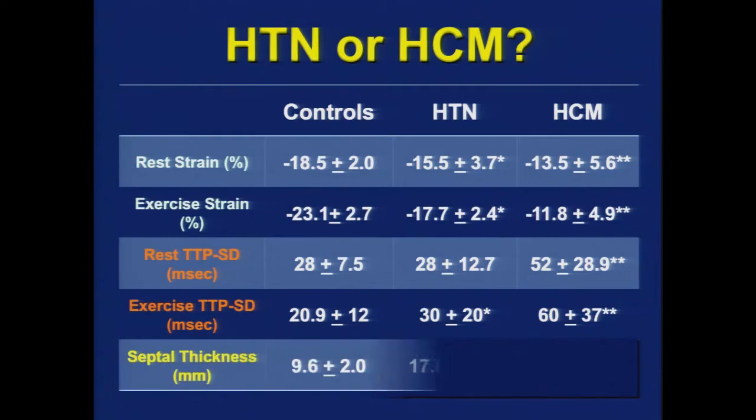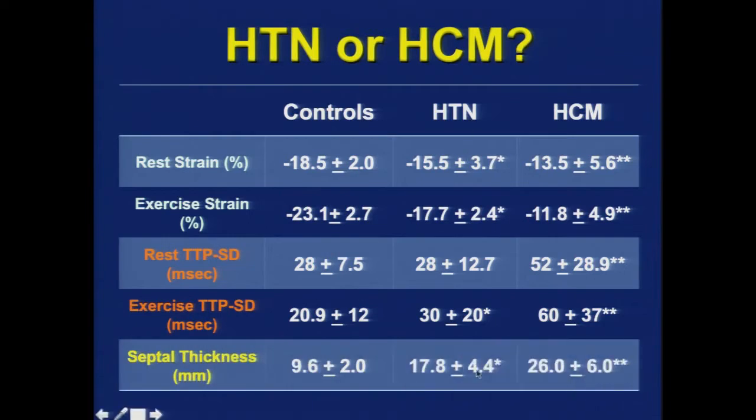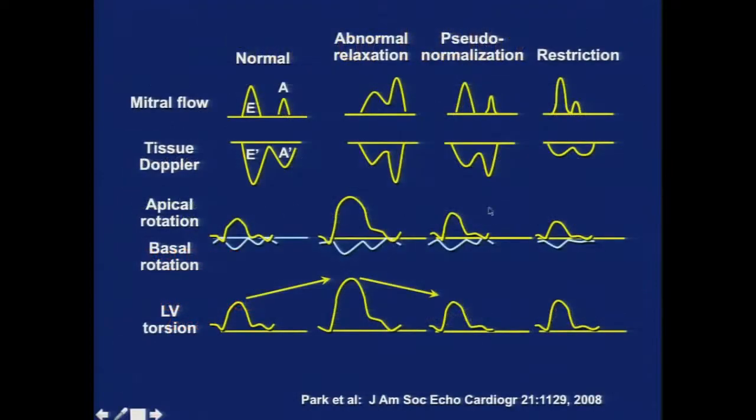But look what you see here in many of the clinical trials. You see the hypertrophs' walls are like 26 and the hypertensives are only 18. That's not a very difficult clinical conundrum because you're not going to see too many hypertensive patients that have walls that are 26 millimeters thick. But what was interesting is what we showed earlier.